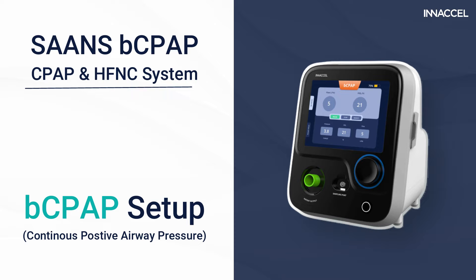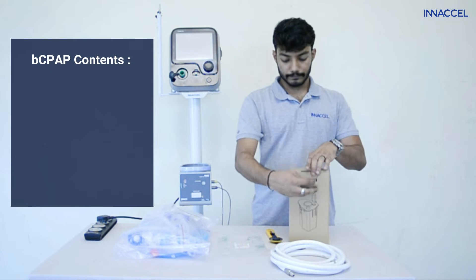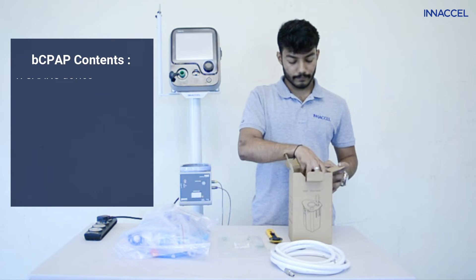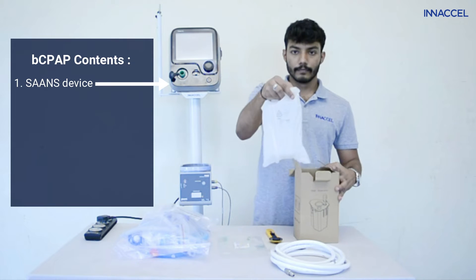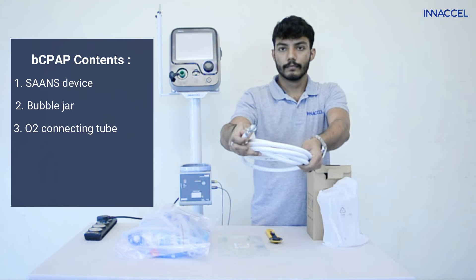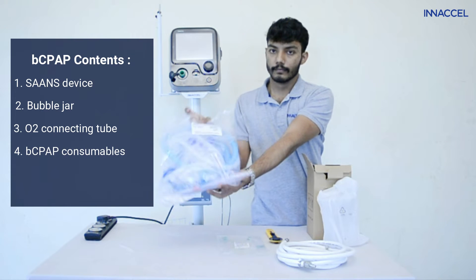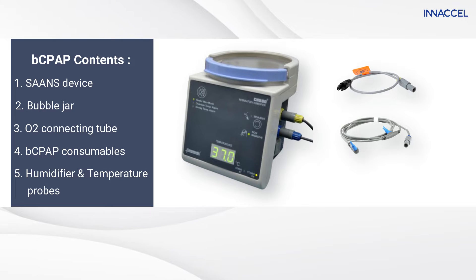Let us show you how to set up SAANS bubble CPAP mode. You primarily need 5 components to use SAANS in bubble CPAP mode: SAANS device, bubble jar, O2 connector tube, the consumables packet, and humidifier and temperature probes.